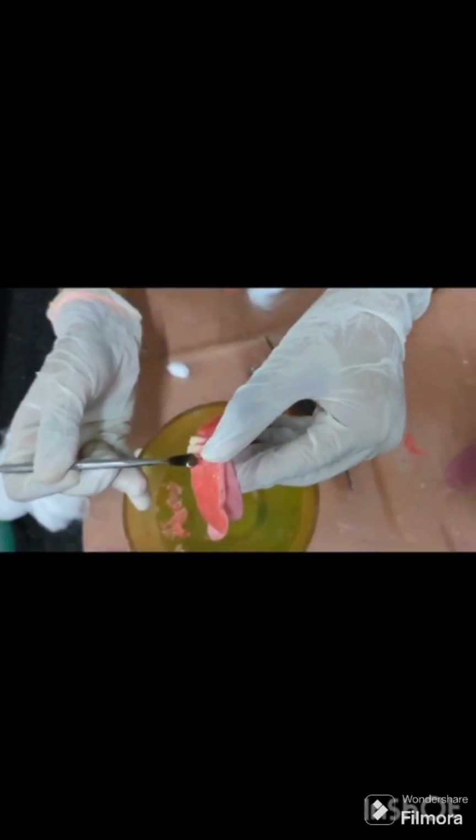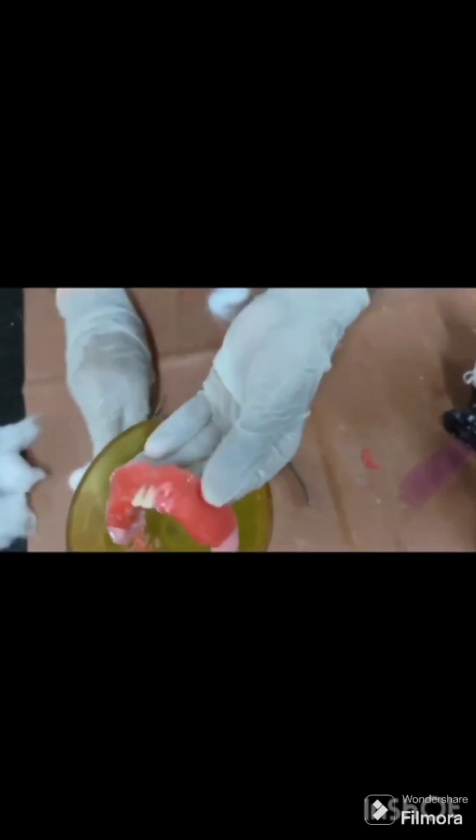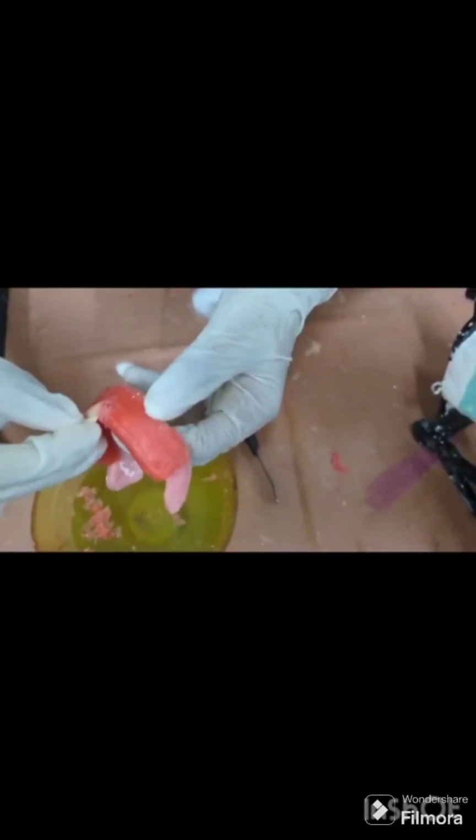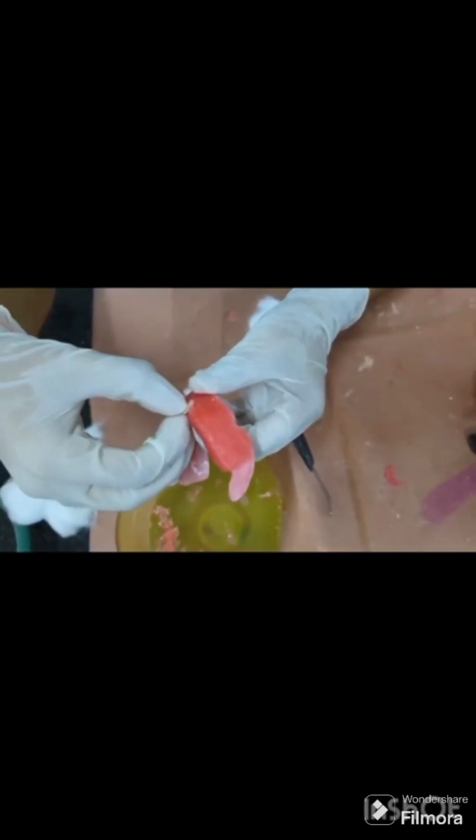Next, arrangement of the mandibular lateral incisor. Its long axis inclines to the vertical axis when viewed from the front. The incisal edge will be 2 mm above the occlusal plane. When viewed from the side, it slopes labially but not as steep as the central incisor. From incisal view, it follows the arch form.